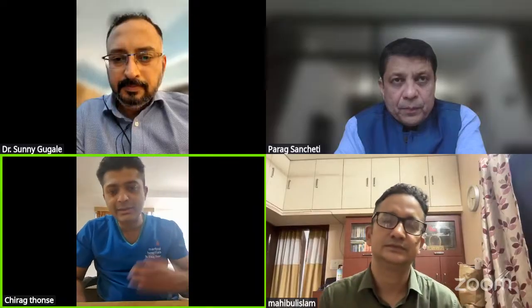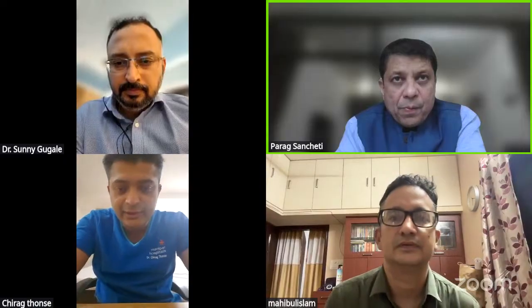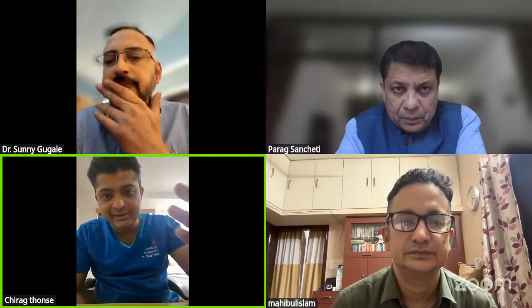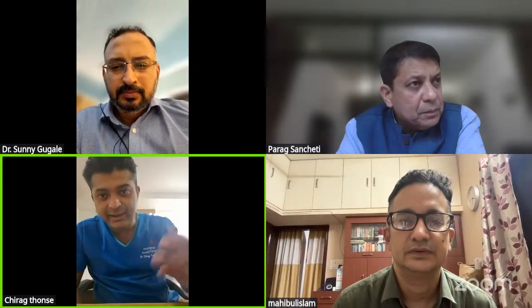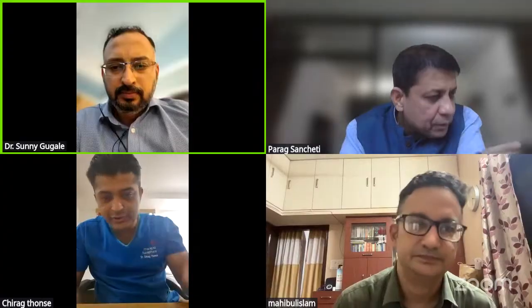So we need to understand the pattern of three types of discoid meniscus. One is incomplete, complete, and the Wrisberg type. In the third type, there's no capsulomeniscal attachment. These are usually free meniscus lying down inside. So you can mistake that as a bucket handle meniscus. You need to identify, is it an intrasubstance bucket handle or inherently it is bucketed. So in case of type 3, of course you resect it out.